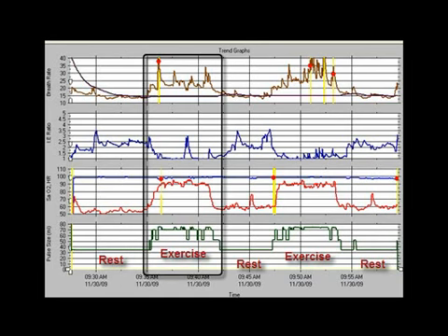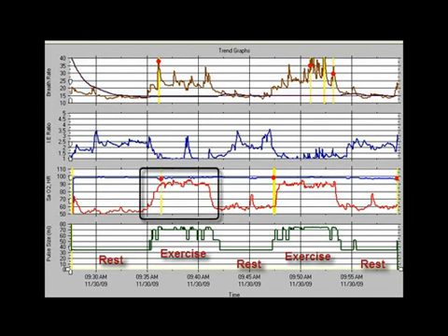Looking at the data now, hopefully it is very easy to see the restful periods from the exercise periods. When I exerted, my breath rate increased and my IE ratio dropped. This is validated from the rise in heart rate. SmartDose monitors these breathing patterns and reacts accordingly. Note that all of this data is coming from the coder that is in line with the unit and is not being reported from the SmartDose unit itself.